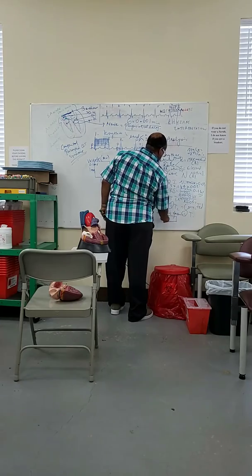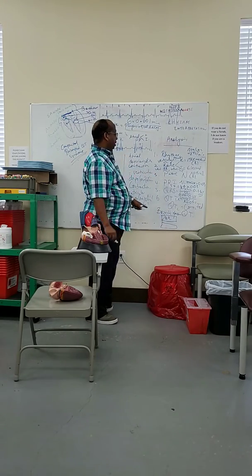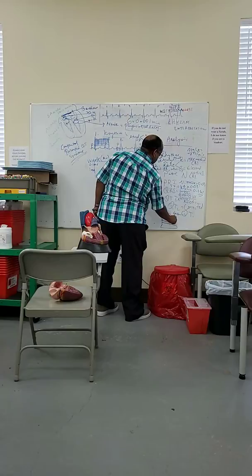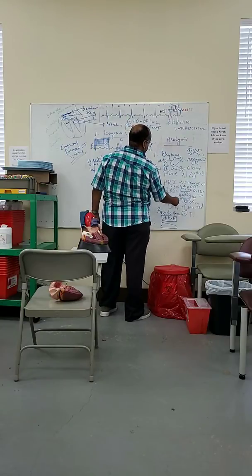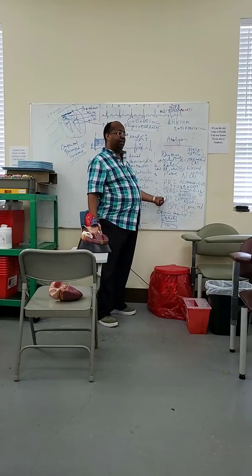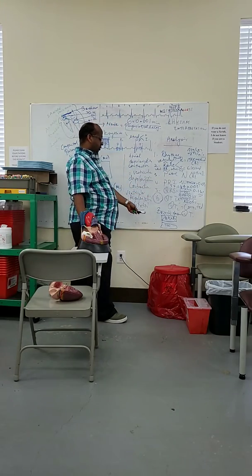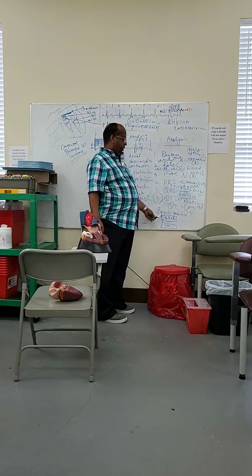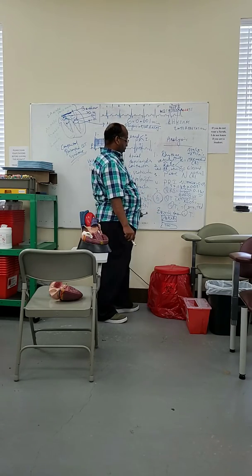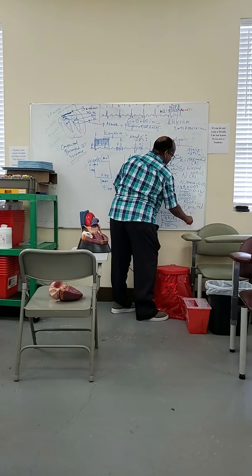You enter the heart rate, the rate that you calculated here, let's say 83, and enter the value of your QT, let's say 380. But if you got the QT in seconds, you need to change it to milliseconds by multiplying by 1,000, because the calculator is in milliseconds. Then you click and get the QTc value.